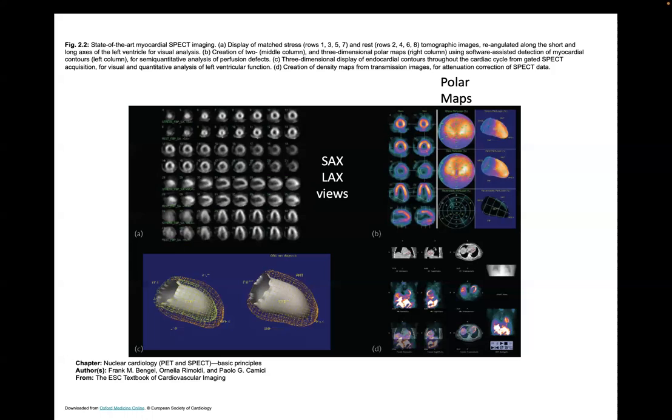Or you could put them on a bicycle and create higher blood flow in their myocardium to see if the myocardium, or the heart itself, the system, can respond to that stress. And so that's this top row. And this row here is what that person's heart looked like at rest. So rest can be done either after the stress or it can be done before. So their heart rate is a normal heart rate, and they have the sort of baseline myocardial blood flow.